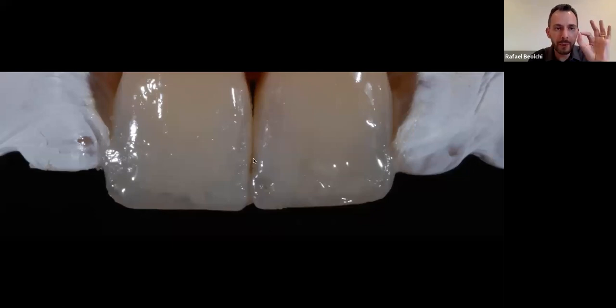This little porosity is very easy to see here because this is macro photography. Clinically, sometimes it's a little hard. When are we going to find out? When we're doing the finishing, and then it is too late, because all the little powders and everything get stuck in there. Very important tip: always seal your composite.